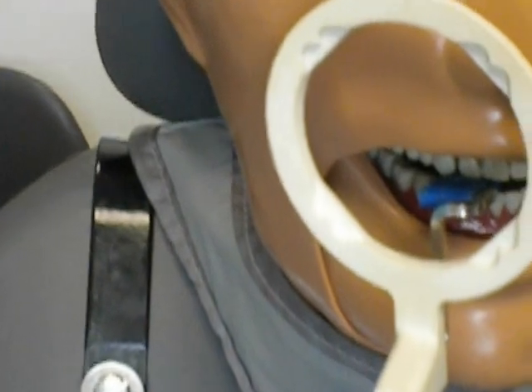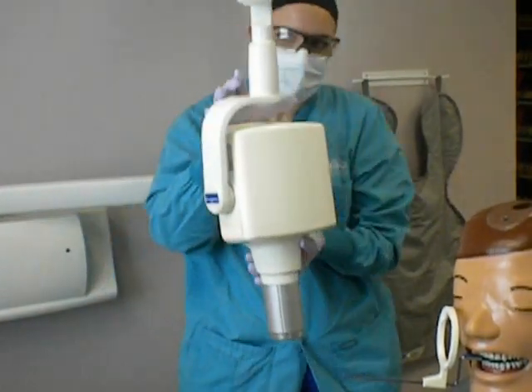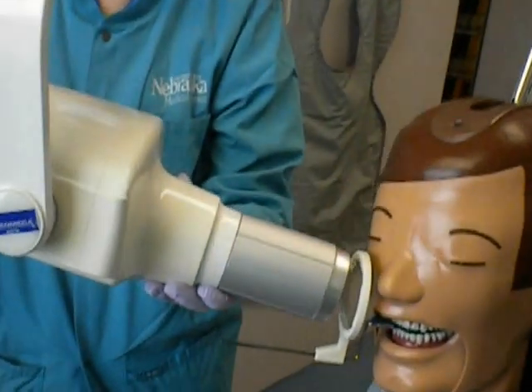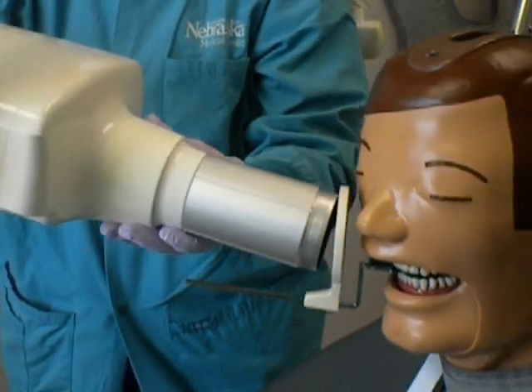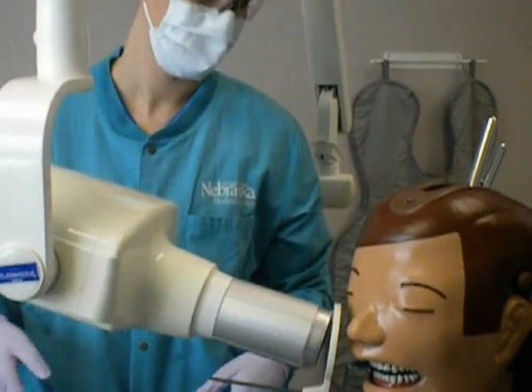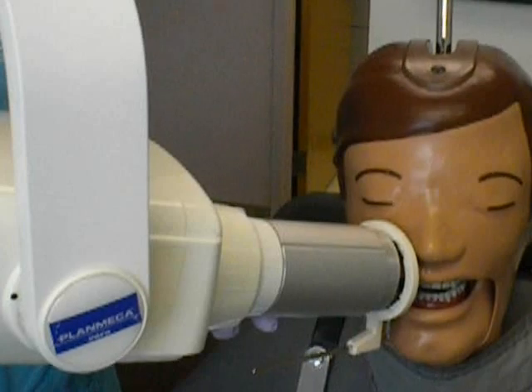Line up the x-ray unit so the horizontal angle is perpendicular, or 0 degrees, to the facial surface of the canine and lateral incisor, with the vertical angle at a positive 30 degrees. You will then line up the central ray with the ring and make sure it is perfectly set up to ensure no errors.